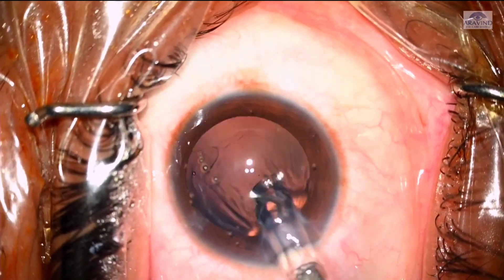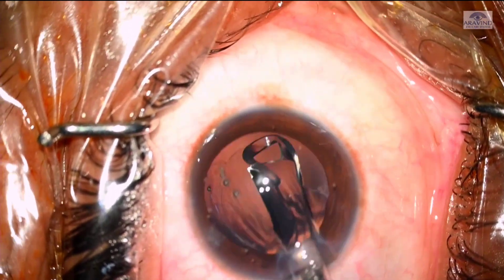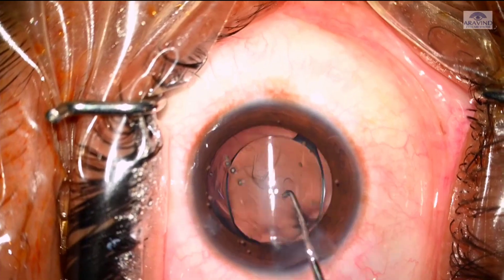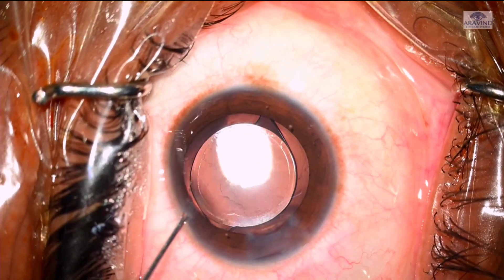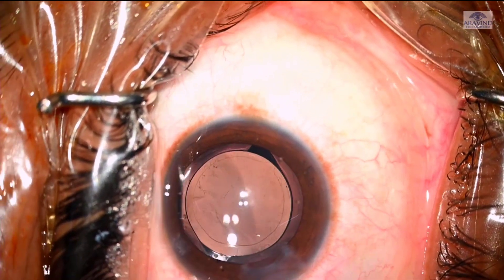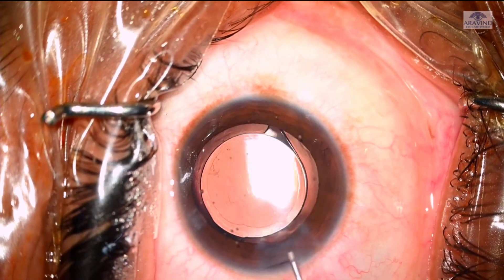A foldable IOL is implanted. The anterior chamber is formed, the wound is hydrated, and intracameral moxifloxacin is injected.